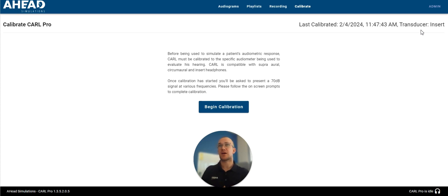But again, if you see that Carl is responding a little bit strange, there may be a need to recalibrate it. Obviously, if you're changing environment, if you're going from a sound booth to an office environment, or we've even demoed Carl at a noisy conference room, you will need to recalibrate that, and you'll need to make sure that it's calibrated for the transducer that you chose at the time.